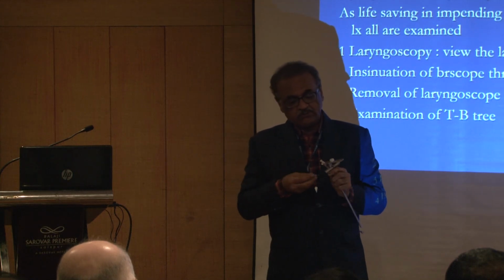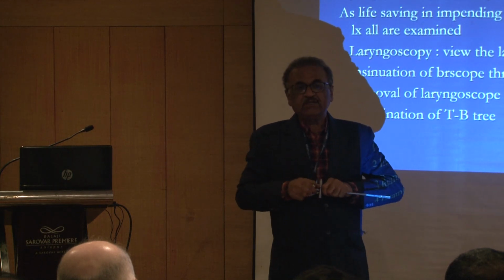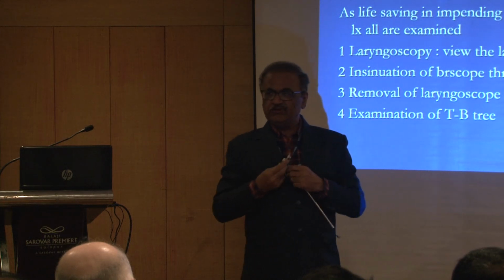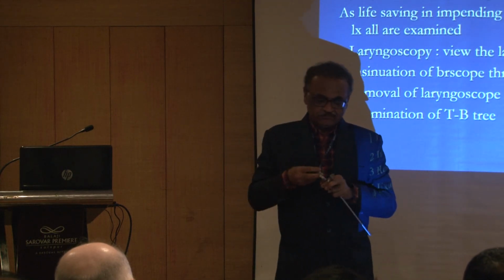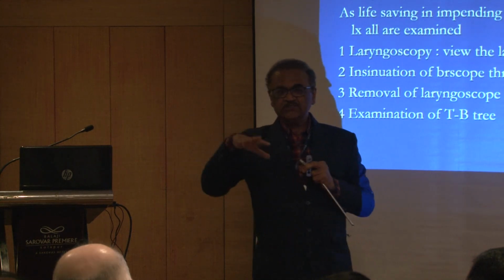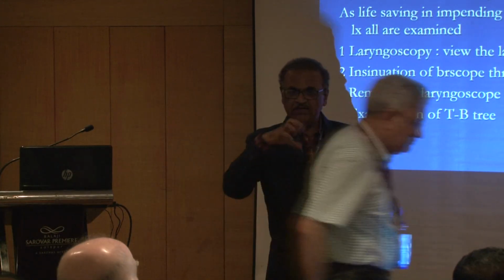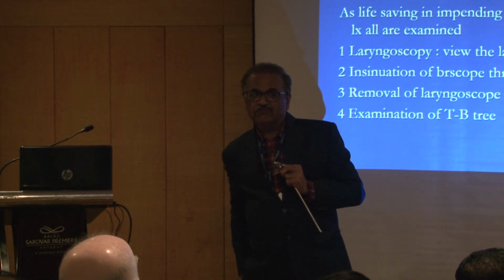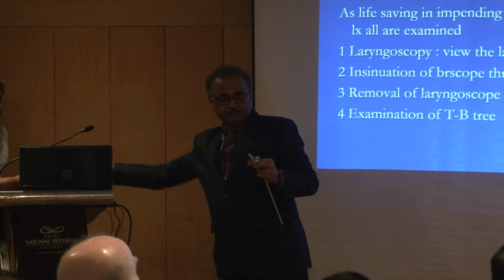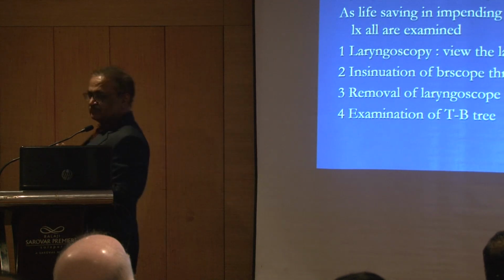But it is not a must that everybody should have this. You can still get away with your non-ventilating bronchoscopes also. If the oxygen is falling, it is better that you ventilate, and then you can definitely increase the oxygen level.